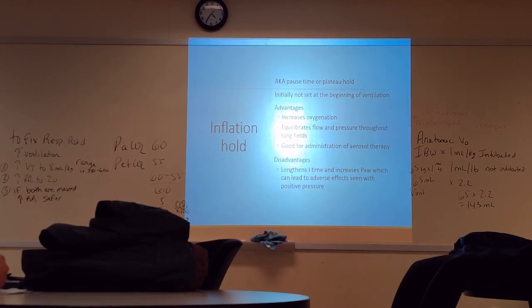Now, our inflation hold is also known as our plateau hold. We've done this a whole bunch of times. Plateau pressure references alveolar pressure. We don't want it to be really high. Remember, when it's creeping up on 30, that's not good.